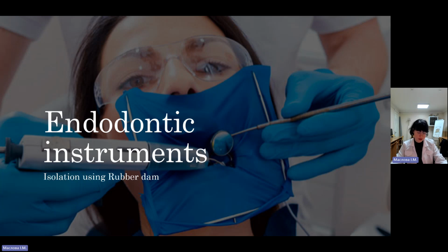There are many good reasons for using rubber dam. It protects the patient from inhalation or ingestion of instruments, medicaments, and debris. It prevents infection by providing a clean, dry, aseptic working field, free from salivary contamination. It allows retraction of soft tissue, does not obstruct the operating field, and also protects the tissues from injury. It enhances access, improving the efficiency of treatment. It provides better patient comfort without the oral cavity being flooded with water and debris.